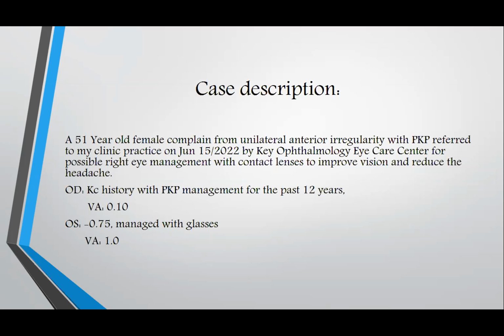In the right eye she had a history of keratoconus and was transplanted a cornea 12 years ago. The best corrected visual acuity was only 0.1. The patient was really upset and unhappy with this result. The left eye was managed with glasses.